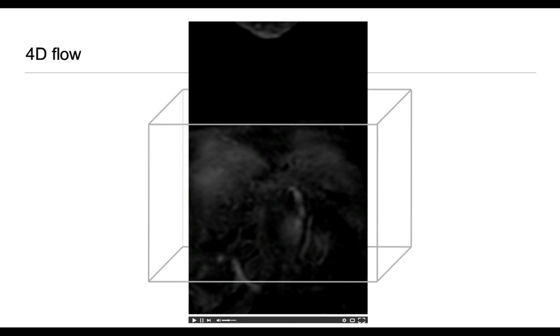Okay. So what you will see in the upcoming video here is a coronal reformation of the large vessels and the heart and the chest, and the gray box represents the volume over which we acquire flow data. So if you can play the video, Jack. Yeah, thank you. So then we move on to the next slide.